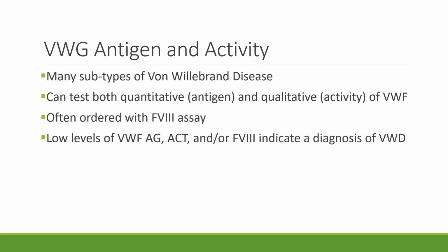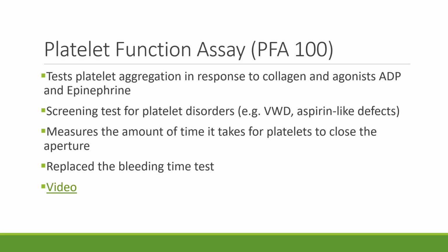It gets a little bit more complicated than that, but for now, this is the big picture of what you need to know about testing. Although we haven't really discussed platelet function because that is part of our primary hemostasis, we're going to go there next. Let's just do a brief overview about some of the testing that we can perform.